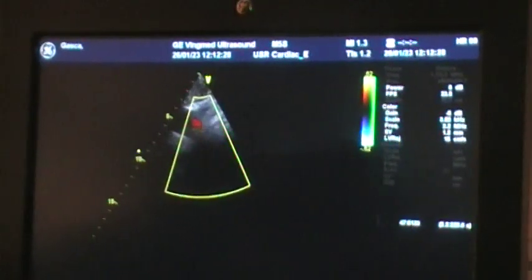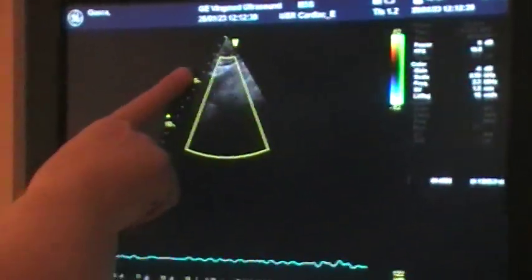And we're going to put color on that. The ascending would be red because it's coming up. This could be red or blue because it's kind of going parallel to us, and then descending should be blue. Good descending there, we would capture that. You're going to continuous wave just to get the highest velocity through there.